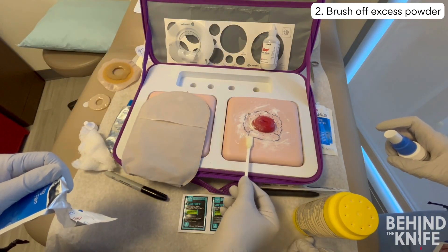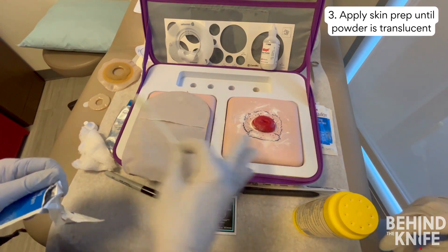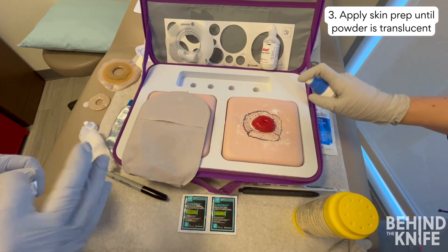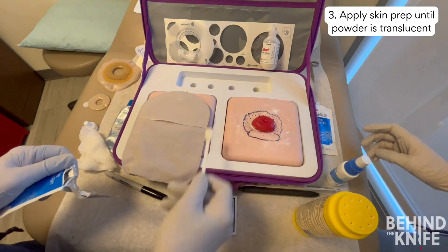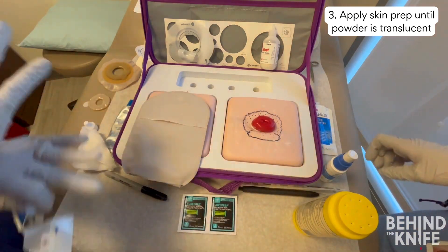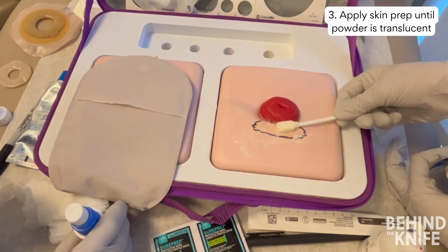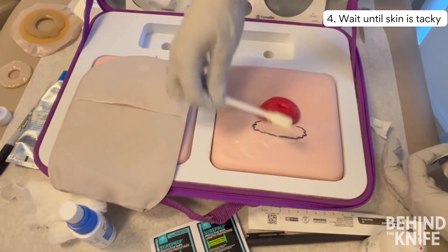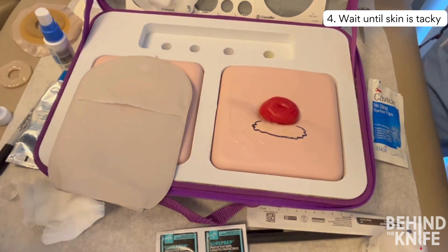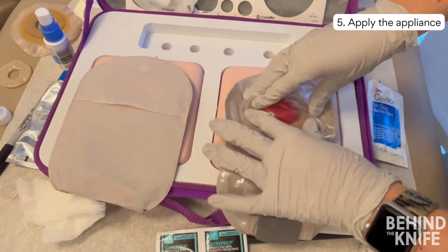Once your powder is set, you should add a skin prep. Skin prep comes in many different forms including sprays, towelettes, and lollipop applicators. Which one you use is not important, but the way you apply it is. Press the skin prep into the raw areas until the powder becomes translucent. Wait until the skin prep is tacky when you touch it, then apply your ostomy appliance. This skin prep will help your patients heal raw areas and prevent them from getting more irritated skin in the future.